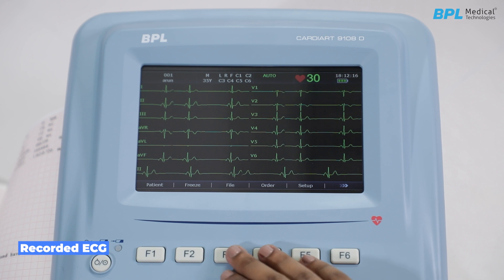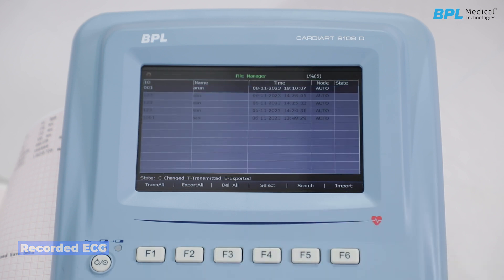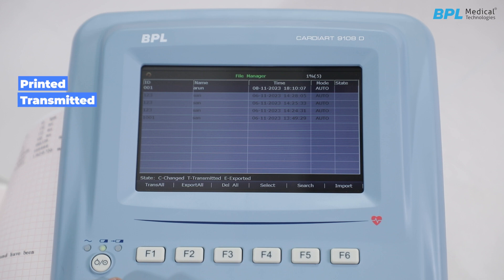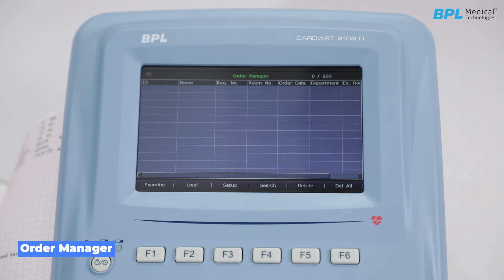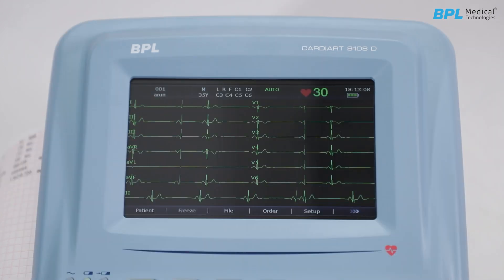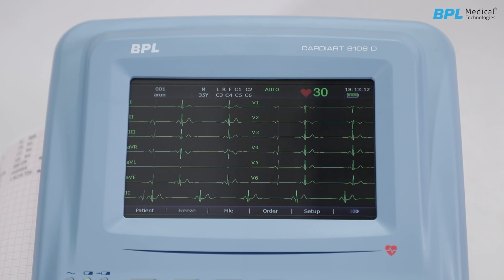To view the recorded ECG, press F3 for the file manager. From this menu, you can transmit data to software, export all data to USB, or select individual data for further action. On the file manager screen, files can be printed, transmitted, exported, displayed, edited, searched, or deleted. Press F4 for the order manager, applicable with the PC software, from which orders can be loaded to the machine and a concerned person can select and examine records against a user ID. To summarize ECG recording: enter patient information and click Print. To view data, navigate to the file manager. If you encounter any issues, refer to the user manual.